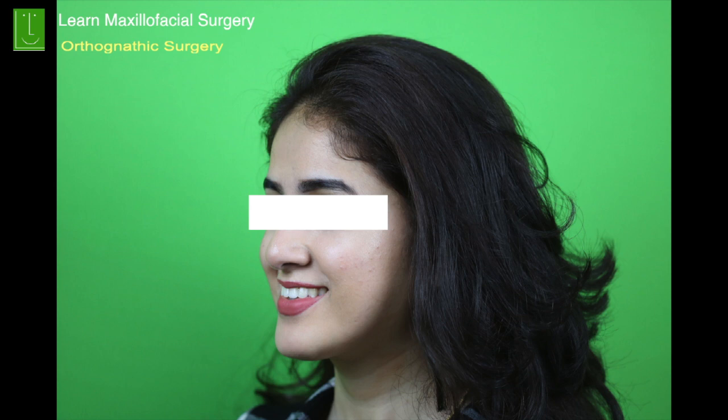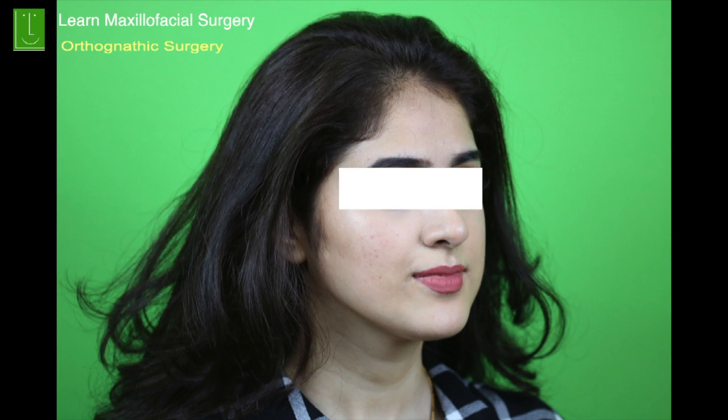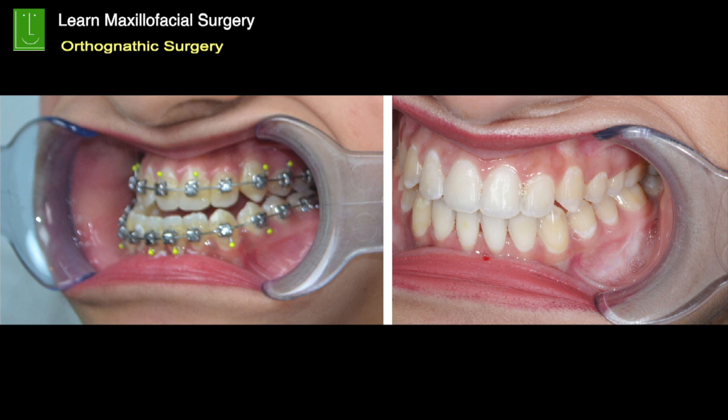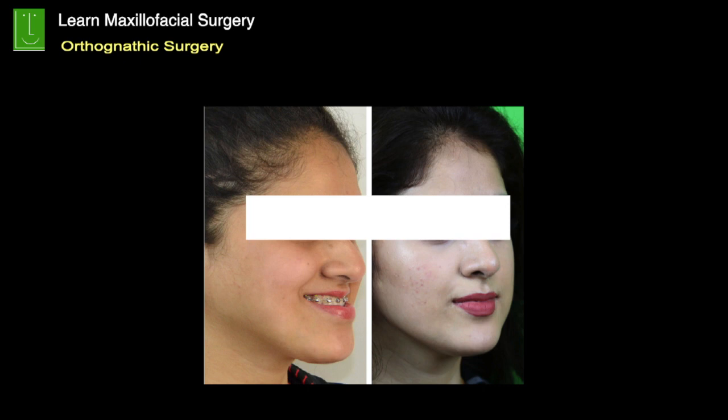You can see the beautiful contour which has been achieved from a very prognathic mandible, and we've been able to get it without giving any scars on the face, and that's the occlusion. Post orthodontics, you can see the way in which we have completed it. Pre and post, both from the front and back, you can see the kind of transformation of the patient which you can do when you get these kind of patients.